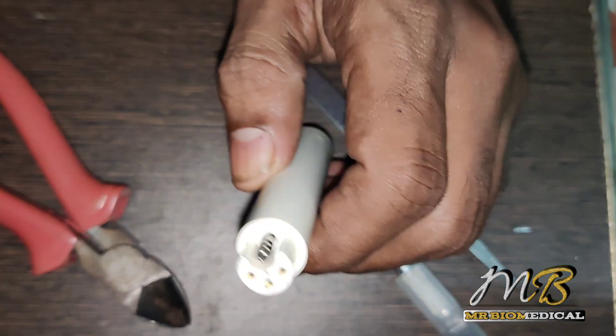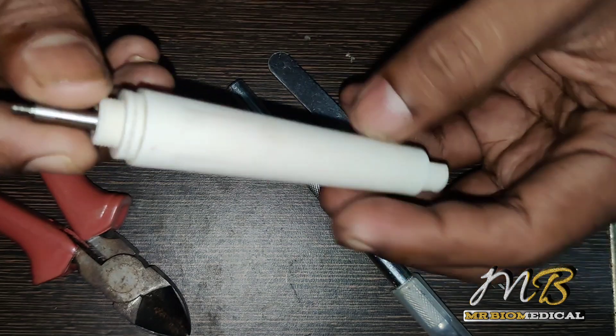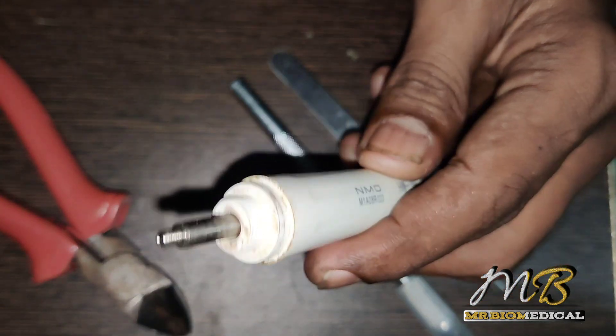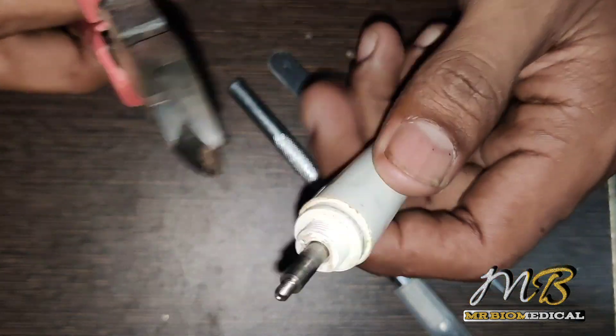Here are the female pins which will be used to connect the male pins. Let's tear it down — I don't know how to start and I haven't opened this before, so I'm using my cutter to cut this one. Let's hope for the best.